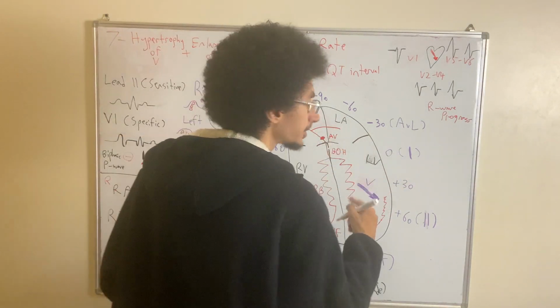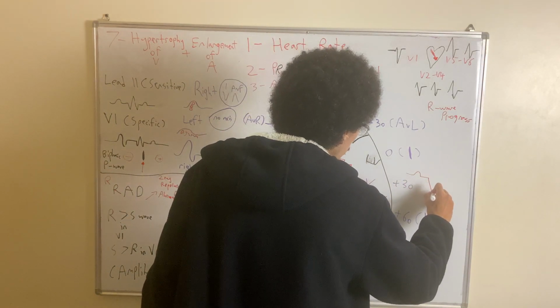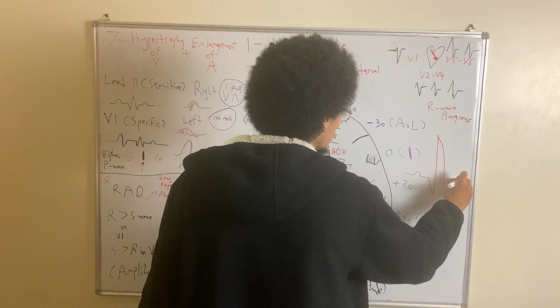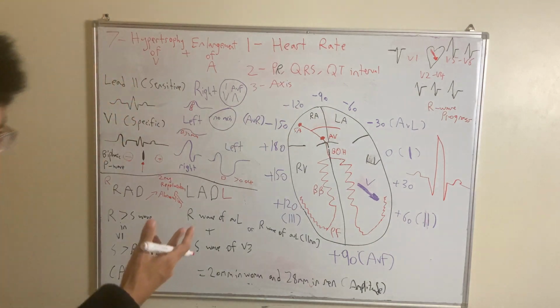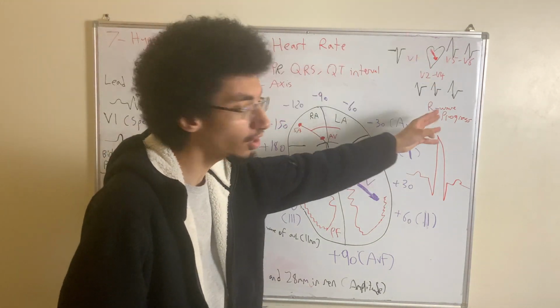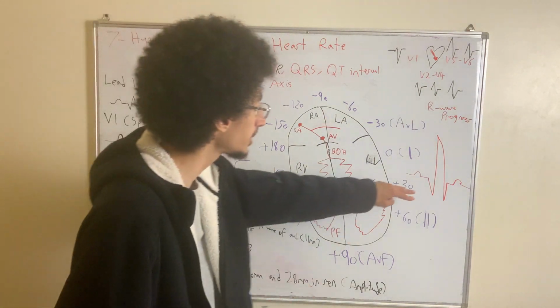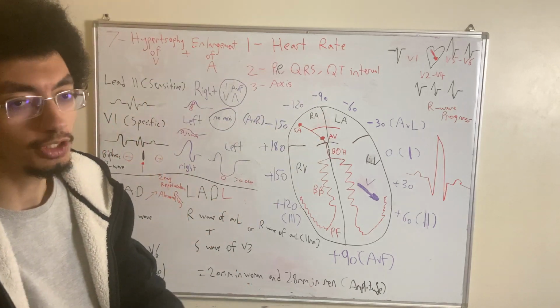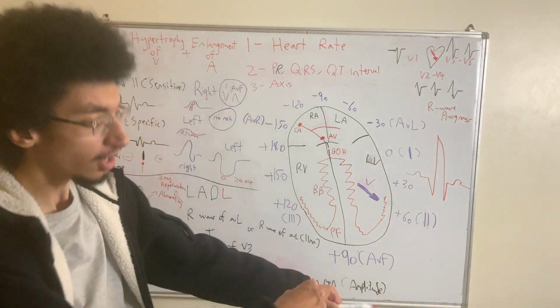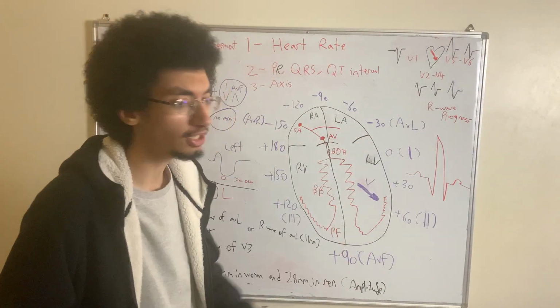So let's say we have an aortic stenosis. That looks like this. P wave, Q, large R wave, then an S wave, then a T wave, right? Let's look at this. Like you see right here, we have a very ridiculously tall R wave in, let's say, lead 2, secondary to aortic stenosis. This suggests there is more ventricular depolarization. There's more amplitude. That means the left ventricle is contracting even harder. It is being hypertrophied even harder. So there's a very large R wave.